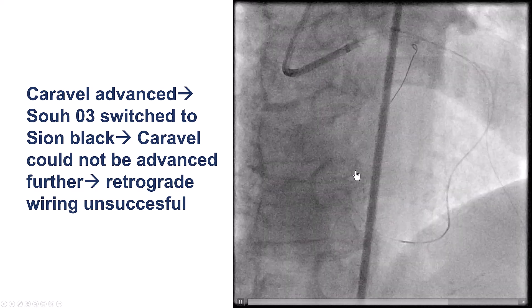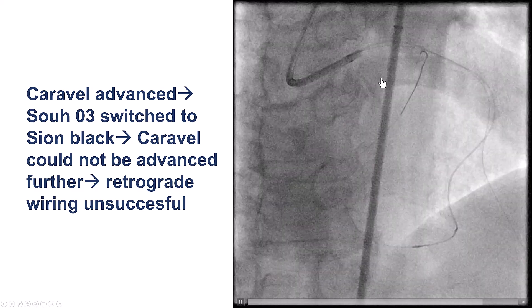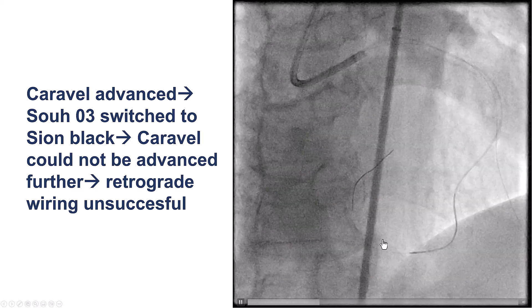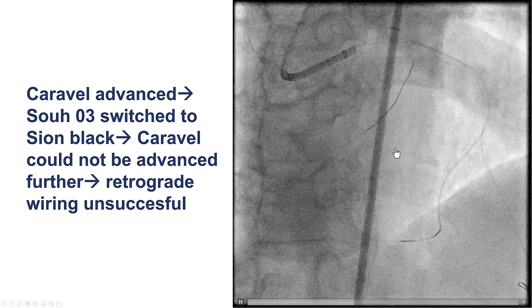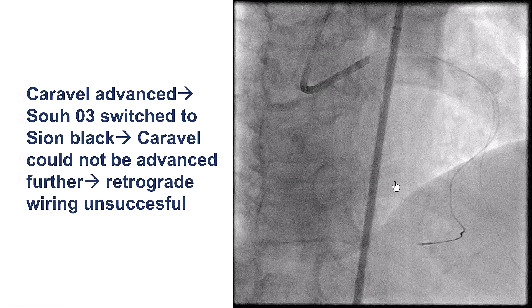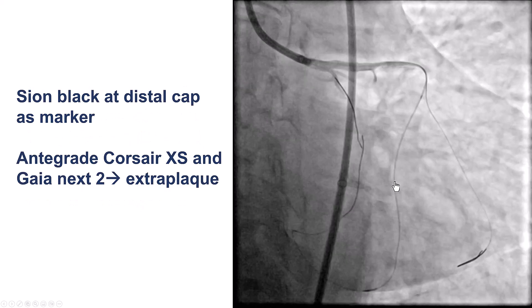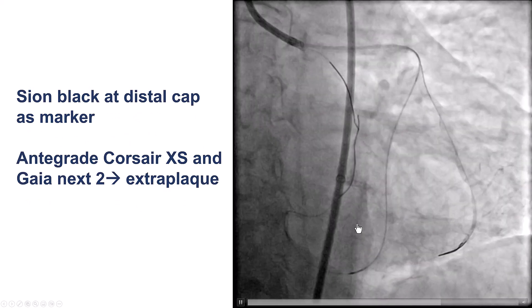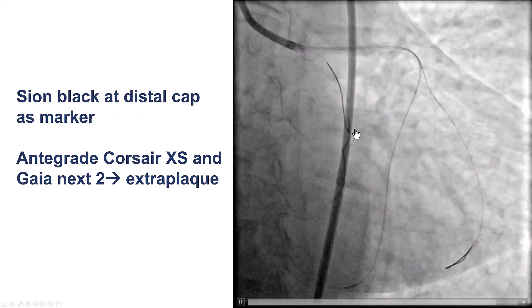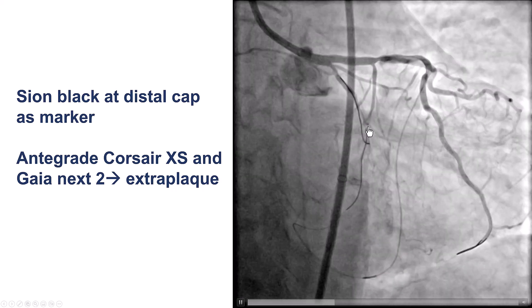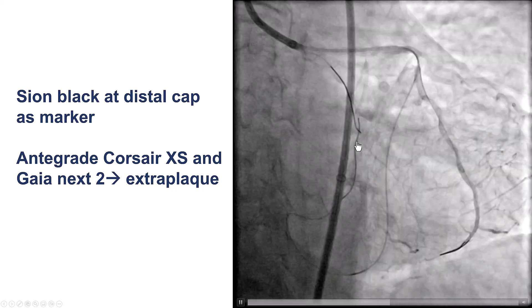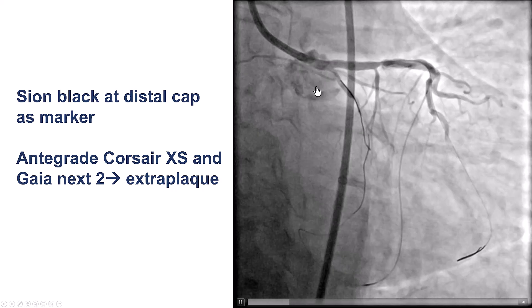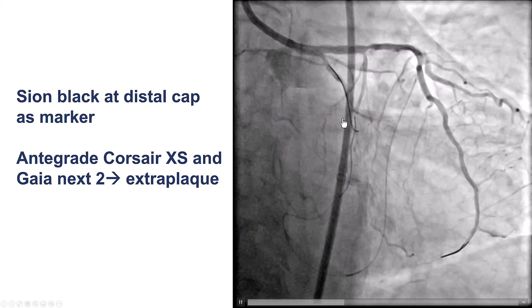If everything fails, one can use the retrograde wire as a marker and proceed with antegrade crossing. What we did was advance the retrograde Sion black wire all the way to the distal cap and use that as a marker for antegrade crossing.